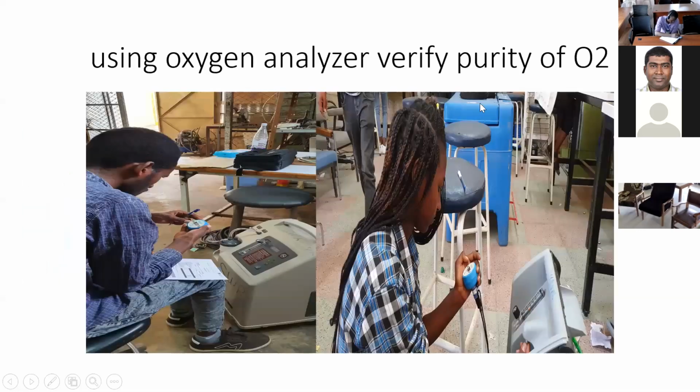Okay, how to use the oxygen analyzer with the oxygen concentrator to verify purity. You can measure through the humidifier or you can measure directly, and you need to adjust the flow meter. So that's how you do it.